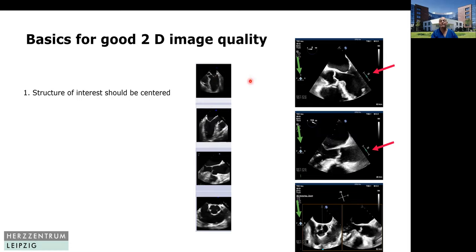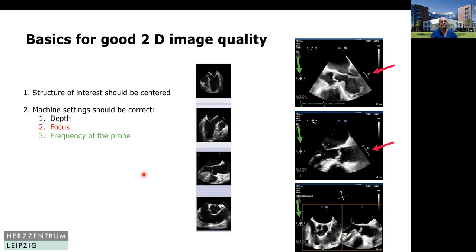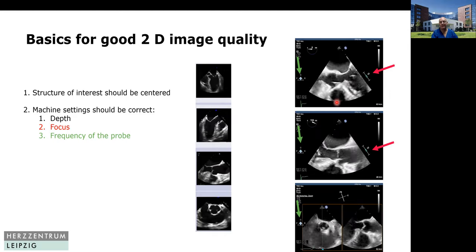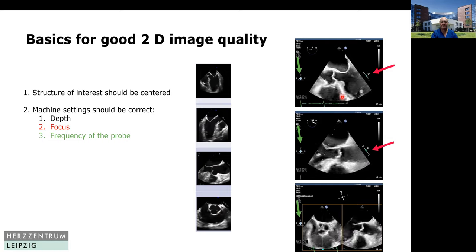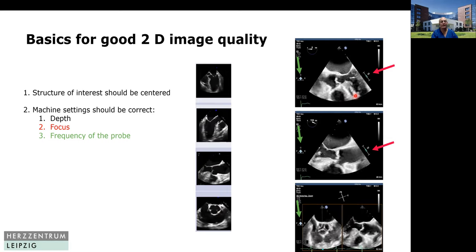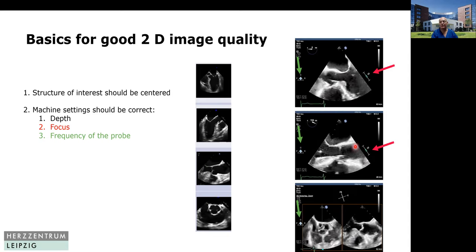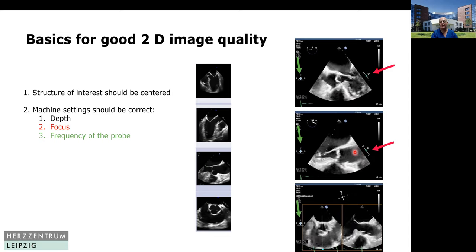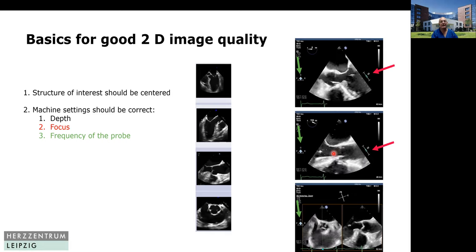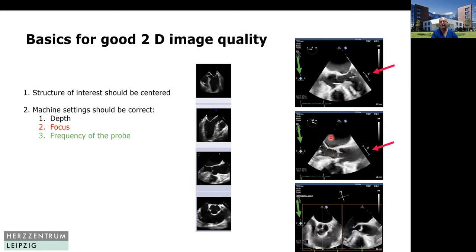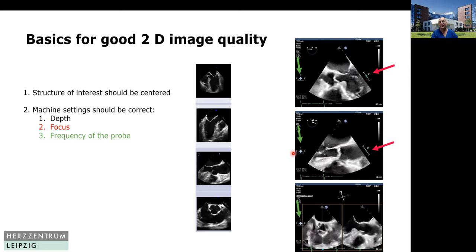You can modify the five-chamber view by turning the probe a little bit more to the right, so that you have your aortic valve in the center. The next thing is the machine settings. That means you adjust the depth so you really don't have too much depth. You have to look at the focus — the focus should be at the level of your aortic valve — and you should optimize the frequency. In the mid-esophageal views, normally you have the best aortic image.